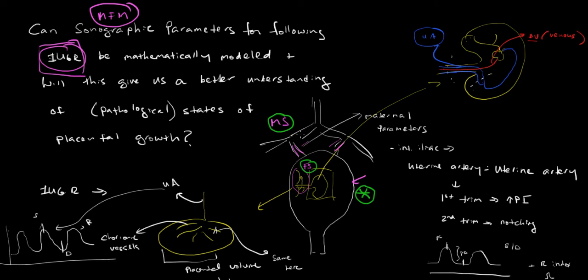So the uterine arteries can be subjected to Doppler flow assessment. And if, for example, there's a suspicion of IUGR in the first trimester, so I wrote here the maternal parameters, the uterine artery could be followed by a Doppler. And if one is doing uterine artery Dopplers in the first trimester, and I'm not going to get into too much detail here, I'm not a sonographer, I'm not a radiologist, the feature that sometimes tips you off that there could be something wrong with the gestation is what's called an increased pulsatility index in the uterine artery, and also increased resistance.